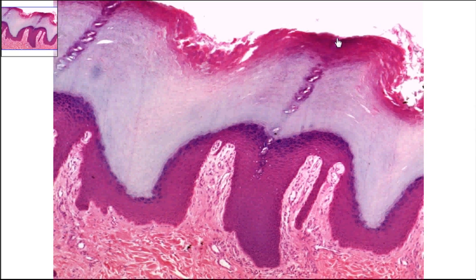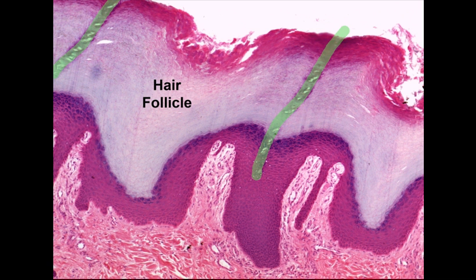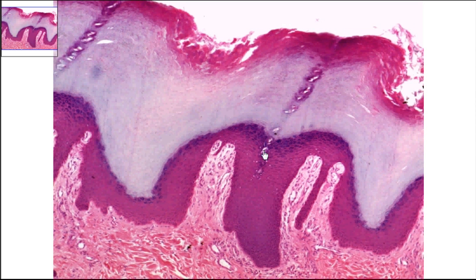Now, if we notice, we have this kind of almost jagged line coming through here. This is going to be a hair follicle. It's not completely visible in this particular cut — you're only seeing little portions of it. This can show you how a hair follicle cuts directly through the epidermis.